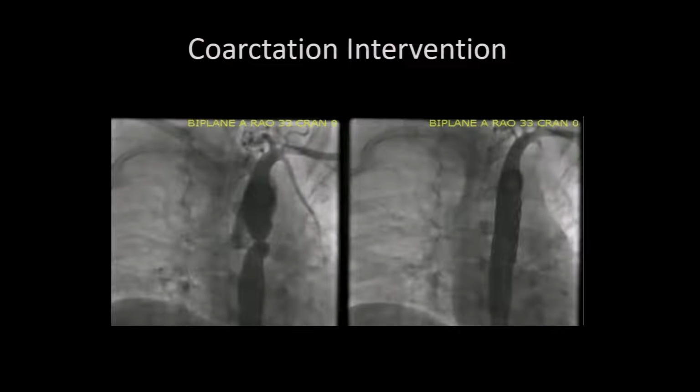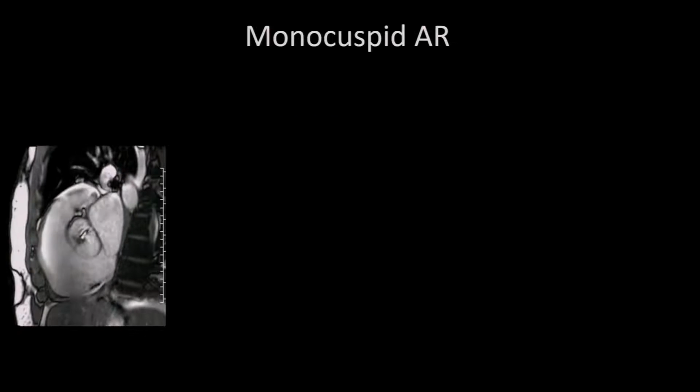It's very important. These patients can be repaired surgically or with transcatheter. This one in particular got a stent. You can see a very good result here.